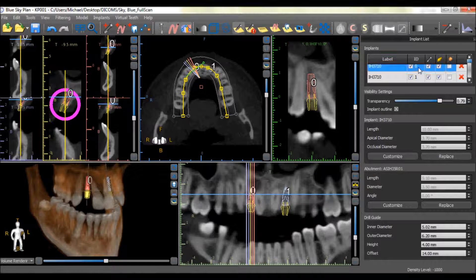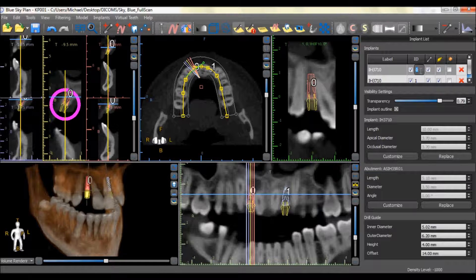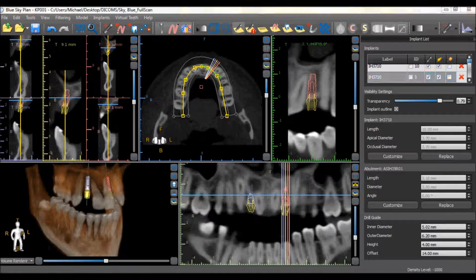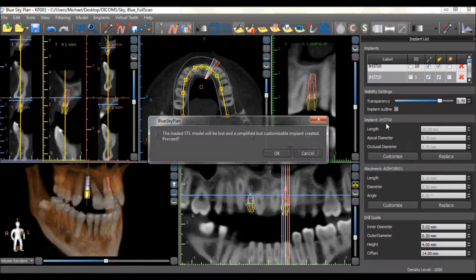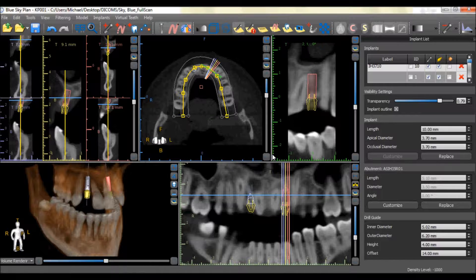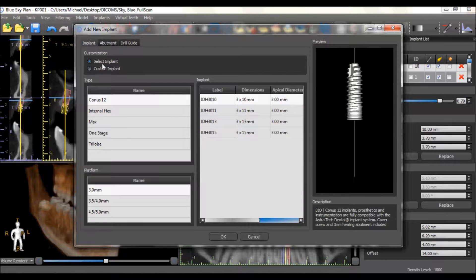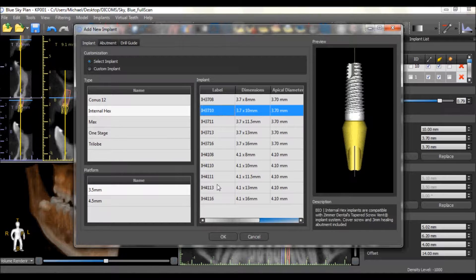The implant ID can be modified by double-clicking on the number in the ID column and changing the implant ID. The implant size and dimensions can be changed by selecting the Customize button in the Implants section. New implant dimensions can be entered into the box, and the Replace button allows you to once again select an implant type from the list.